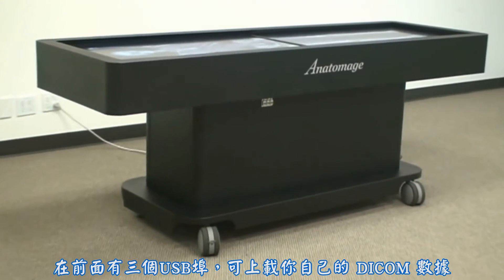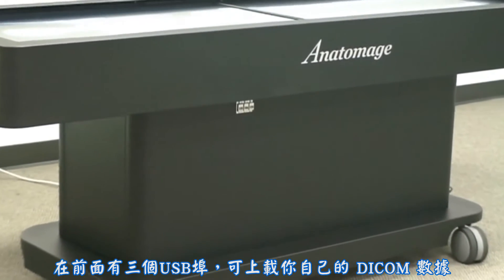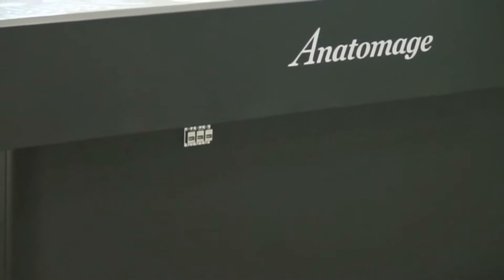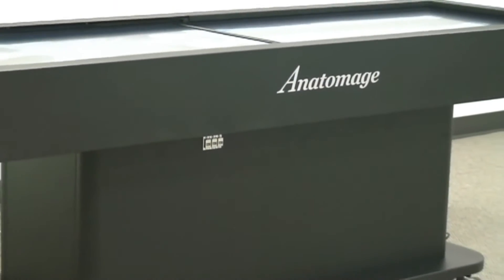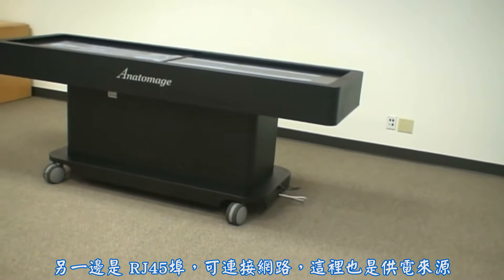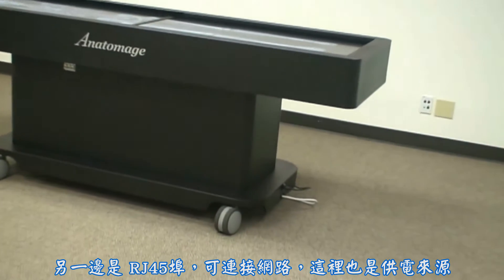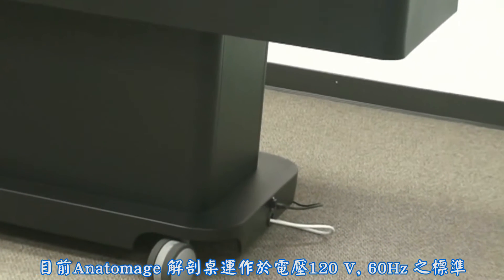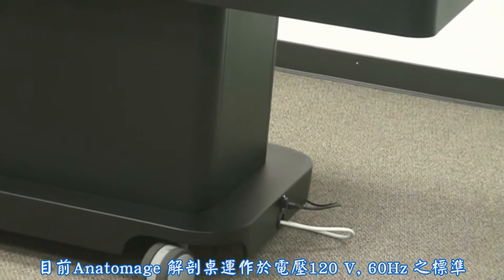On the front are three USBs for uploading your own DICOM datasets. On the side is access to the RJ45 port for connecting to your network. There is also access to the power source. The Anatomage table operates on 120-volt, 60-hertz standard.